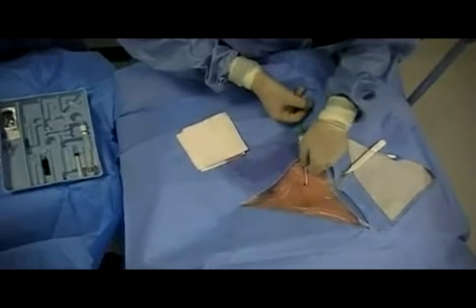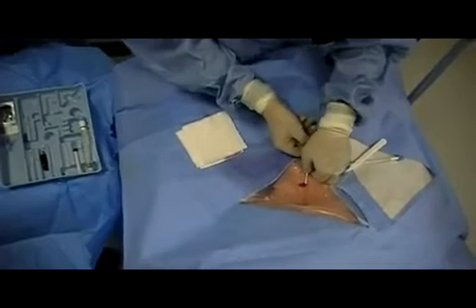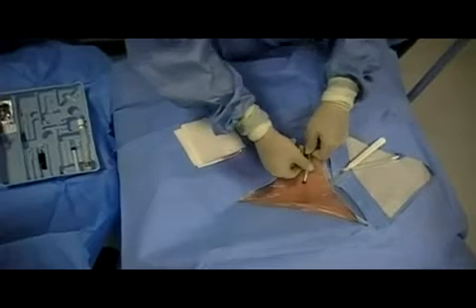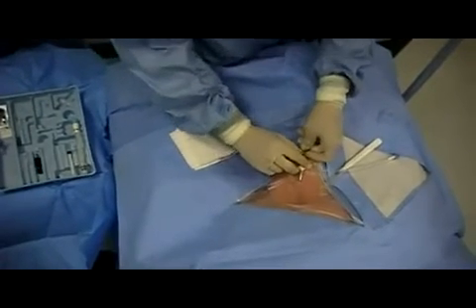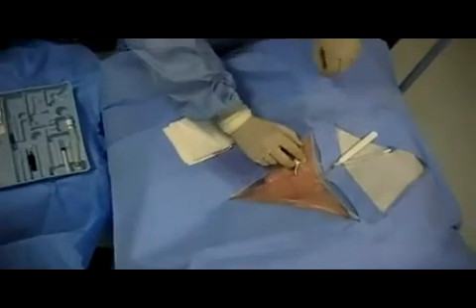Once successful insertion is achieved, the wire is removed as well as the dilator. Unlike typical cordis catheters, there is a valve at the tip of the cordis that will prevent blood from flowing backwards.